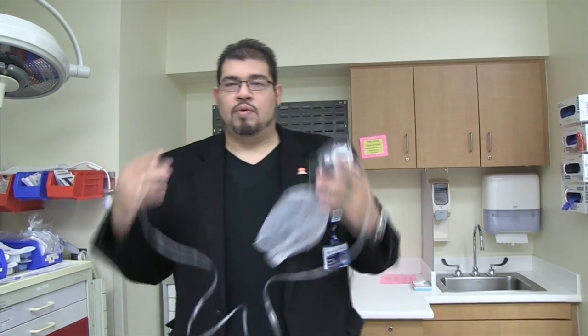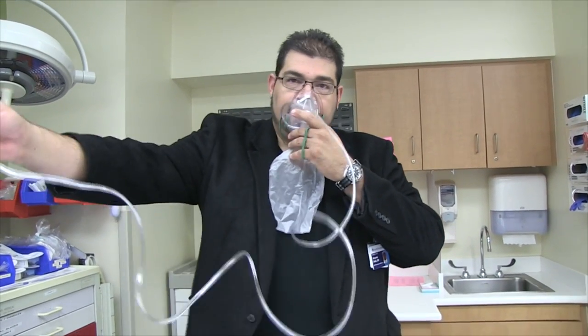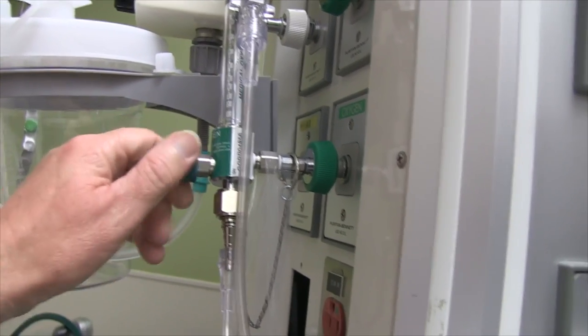You know, and everybody knows the scenario. You have a patient that's really, really air hungry, right? They're incredibly short of breath. You put a non-rebreather on them at 15 liters a minute, and if you can hook that up for me. Up to 15 liters, there we go.